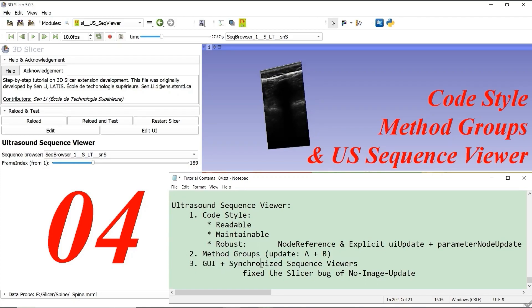In the end, we synchronize two Sequence Viewers and fix the bug of no image update when we change the active Sequence Browser node in the Sequence Viewer given by 3D slicer.